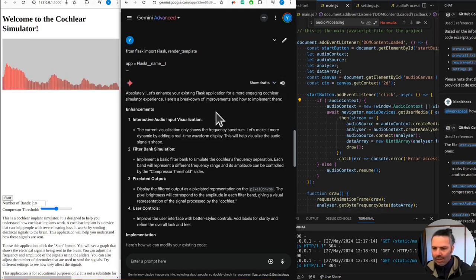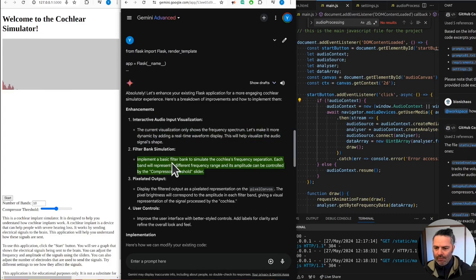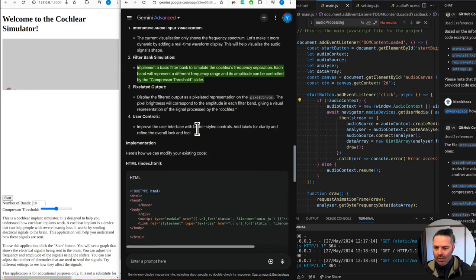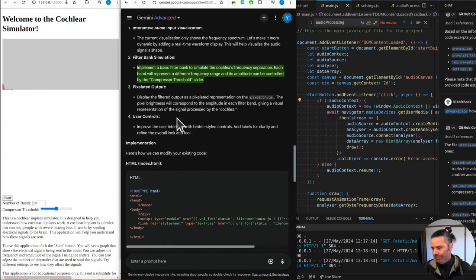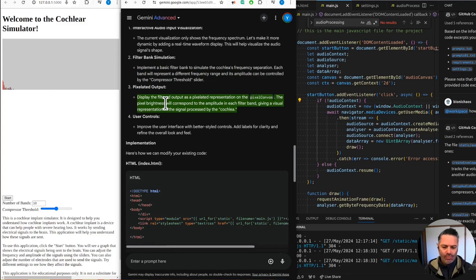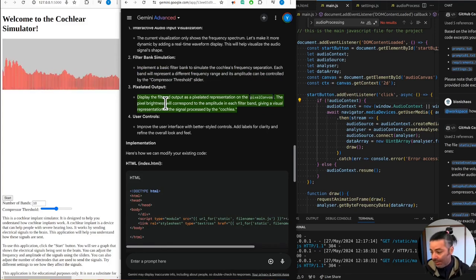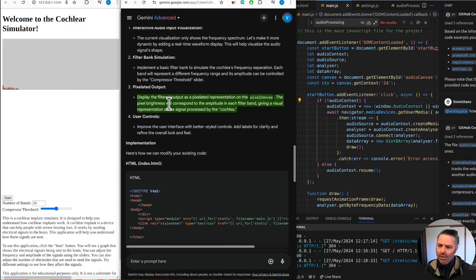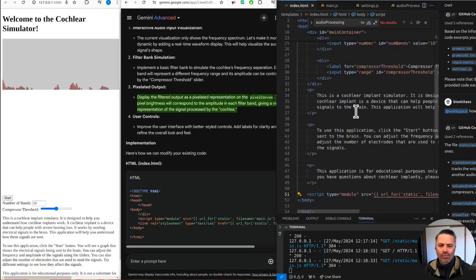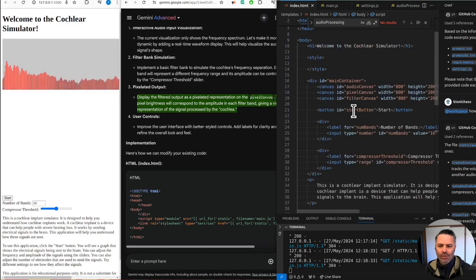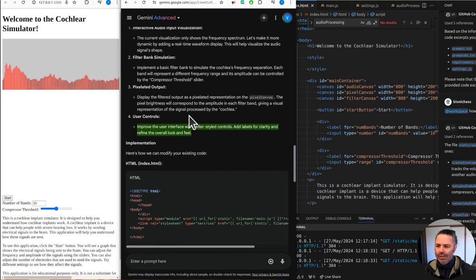The current visualization only shows the frequency spectrum. Let's make it more dynamic by adding a real-time waveform display. This will help visualize the audio signal shape. Implement a basic filter bank to simulate the cochlea's frequency separation. Each band will represent a different frequency range. Display the filtered output as a pixelated representation on the pixel canvas. The pixel brightness will correspond to the amplitude in each filter band.